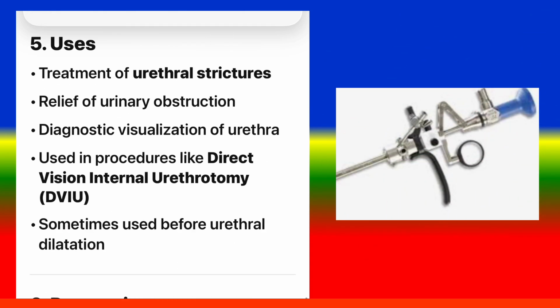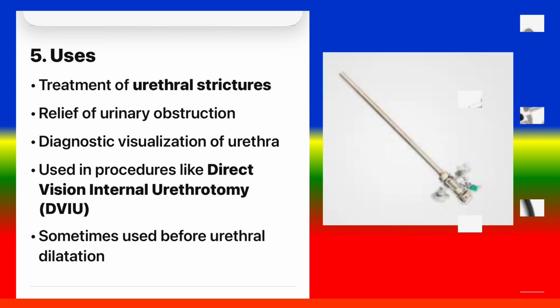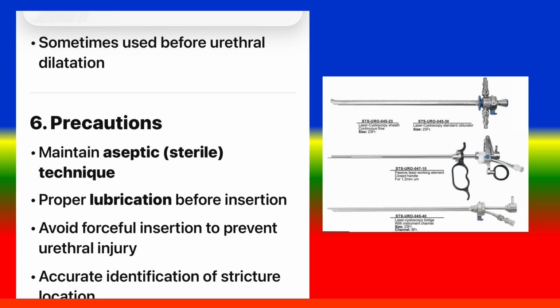5. Uses. Treatment of urethral strictures, relief of urinary obstruction, diagnostic visualization of the urethra, used in procedures like direct vision internal urethrotomy, DVIU, sometimes used before urethral dilatation.